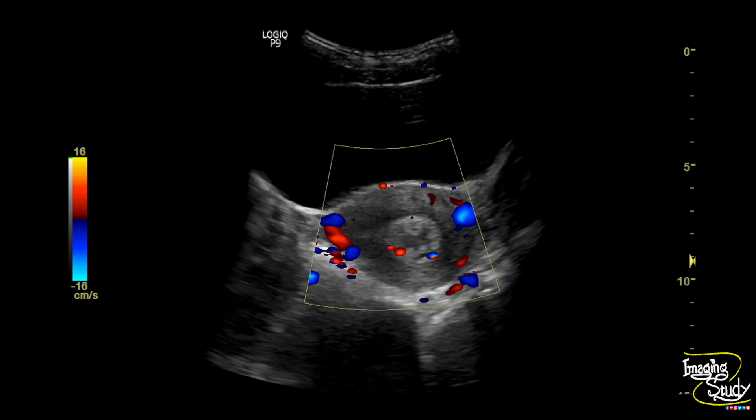Here is the transverse section with color Doppler, and you can see the prominent flow towards the retained products, indicating the presence of trophoblastic tissue.